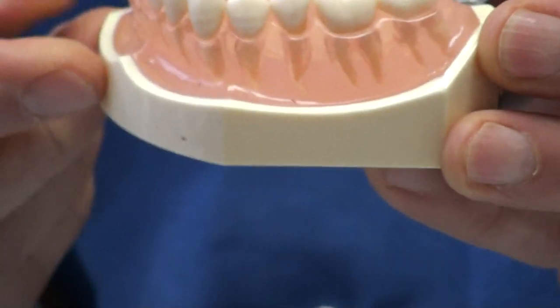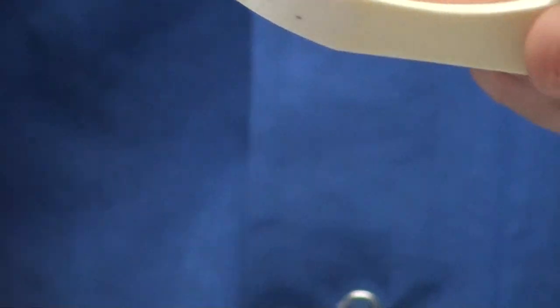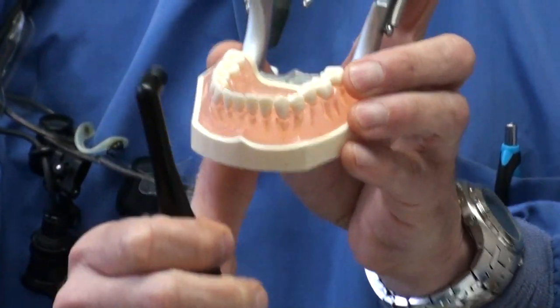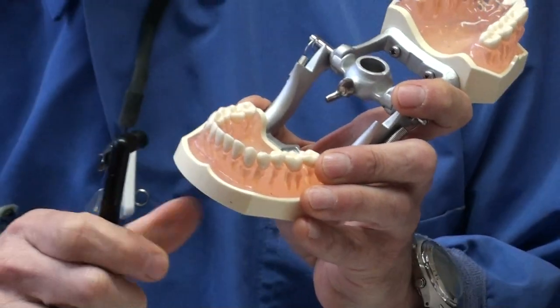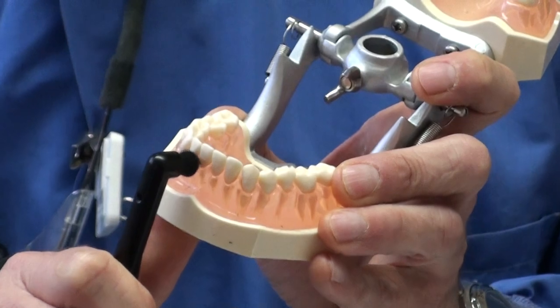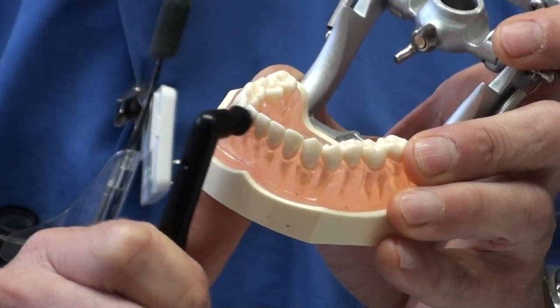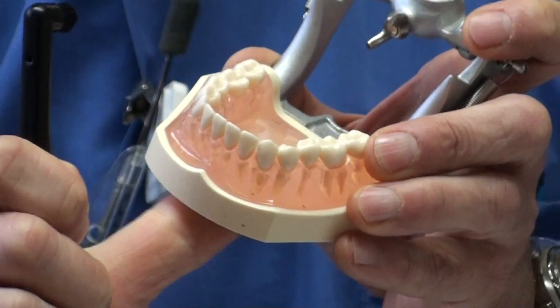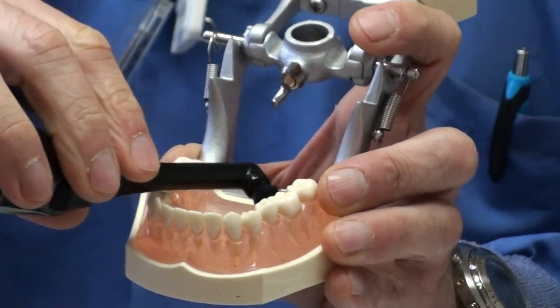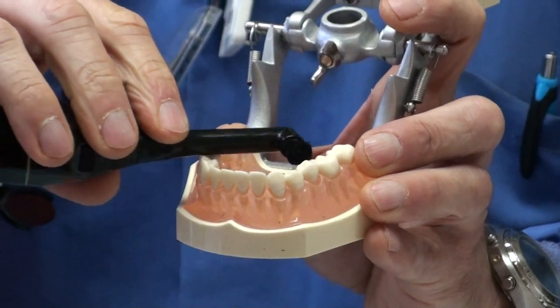Another thing that makes it easy is rather than holding it with no hand rest, if you can get up underneath your chin — and we can pretend this is a chin here — and place it between the teeth, it makes it much easier to do. You have more control over it. So using a chin rest and using the teeth on the opposite side for getting in between the teeth works really well.